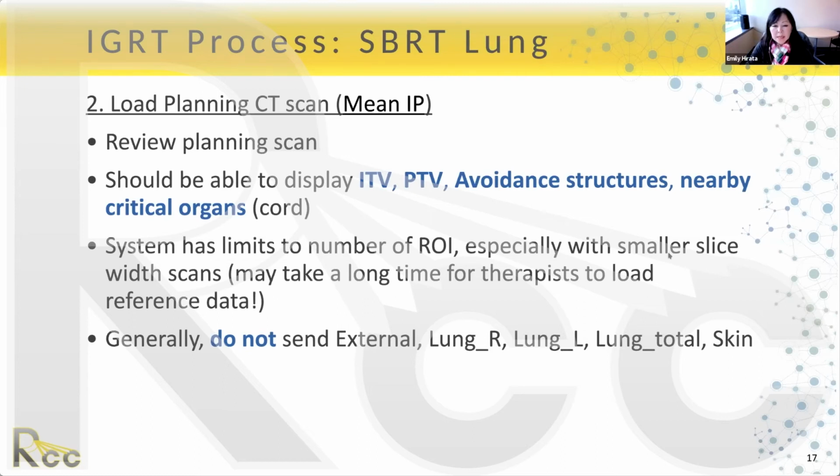So the cone beam CT is not going to be the same resolution. It's certainly not going to be the same quality as your planning CT. But basically what your goal is at the console is positioning the patient. We're not doing dose calculations on the cone beam CT, at least we're not talking about that here. And so you need the cone beam CT to be of high enough quality that you can align, that you know how to set up the patient. So generally speaking, it's okay. In short answer to your question, it's fine.